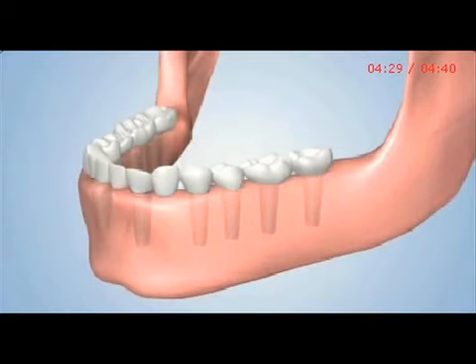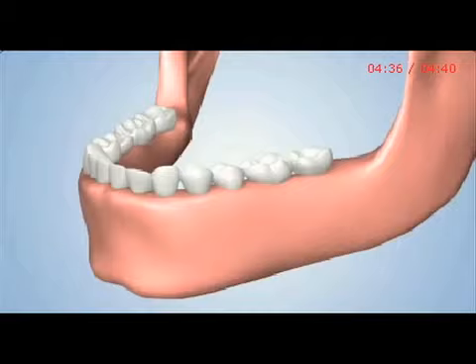Dental implants will provide you with a stable and long-term solution that reduces the pain, discomfort, instability, and bone loss that denture patients experience.